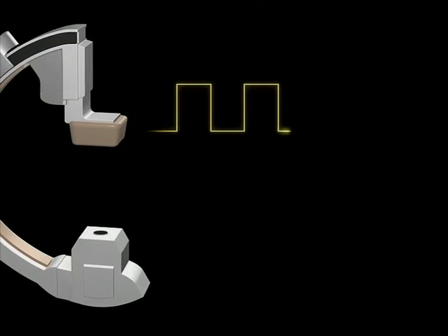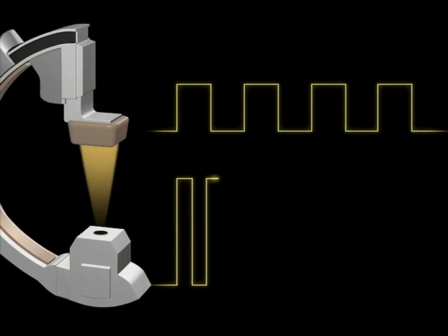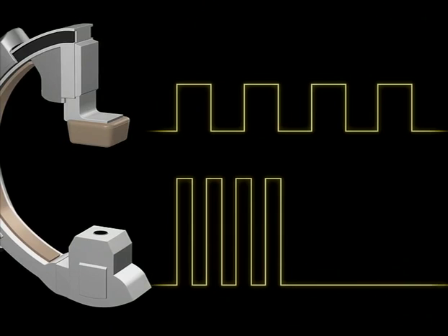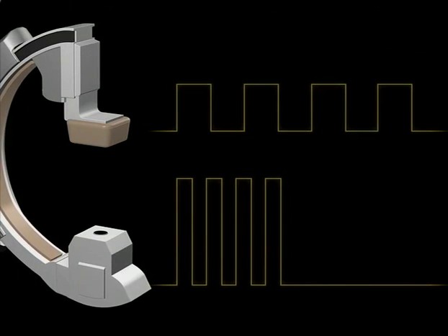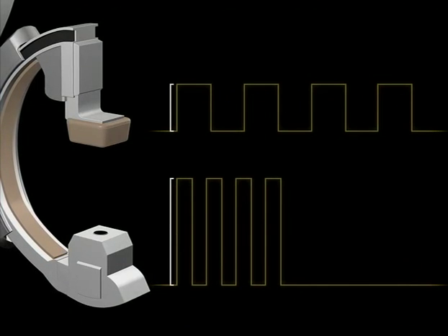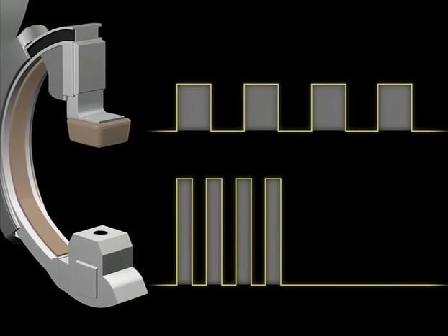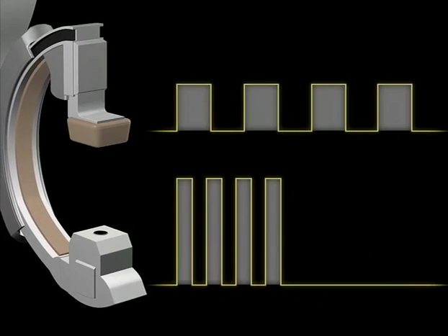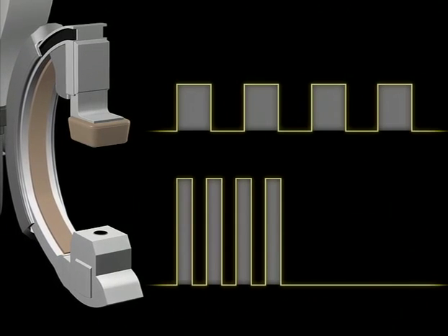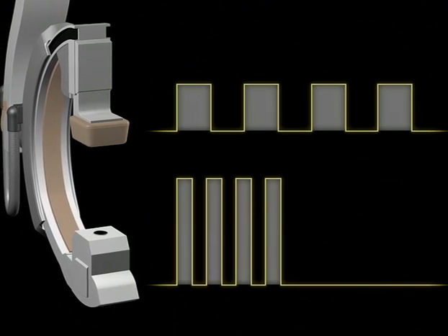The significantly improved image quality offered by pulsed fluoroscopy enables the examiner to reduce the overall fluoroscopy time and thereby decreases the patient dose. Pulse rate, intensity of exposure, and pulse duration have a direct effect on the dose rate in patients and users. Radiation exposure can be reduced by choosing the best examination parameters for fluoroscopy and radiographic series.